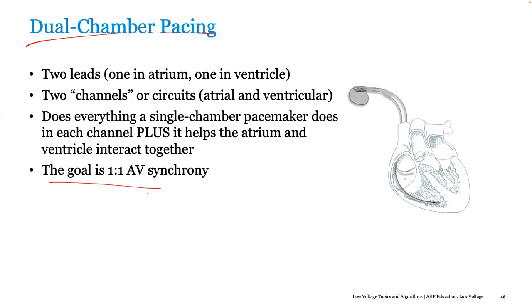I think what's important to understand, especially Dr. Adafi there, is what he was saying: given that most people in sub-Saharan Africa have complete heart block as their indication for pacing, the most basic form of pacemaker is going to be enough for these patients. You're not going to need any of the fancy things. You're just going to need something that lets you program DDD at 50, 60 perhaps, and let them sit like that for 8 to 10 years, based on battery life, obviously.